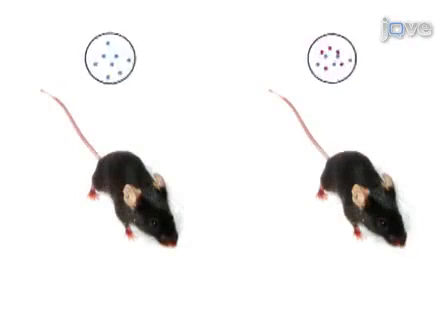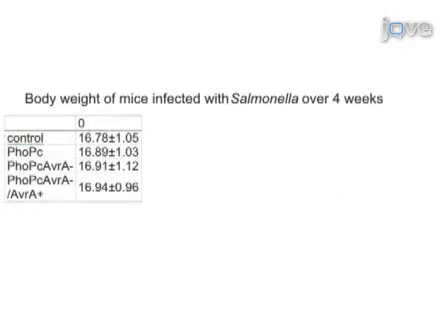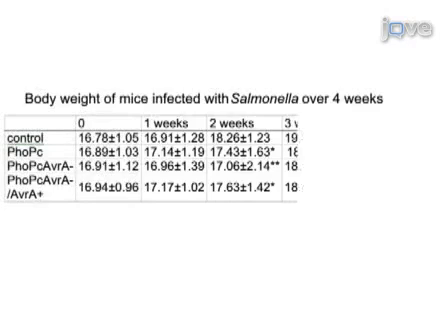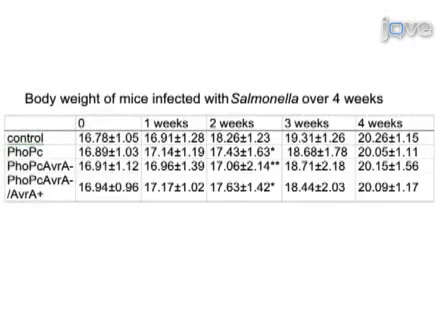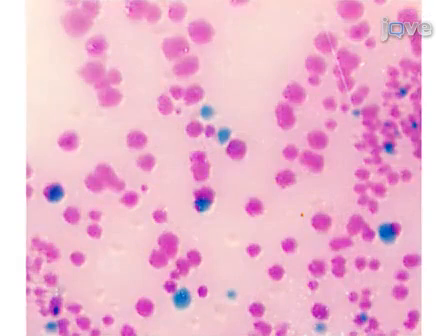The third step of the procedure is to isolate Salmonella from mouse fecal matter and detect Salmonella infection in mouse intestine using BBL CHROMagar plates. The final step of the procedure is to observe and record mouse body mass and note changes in vitality following Salmonella infection. Ultimately, results can be obtained that show an infection of Salmonella can be established in the intestine of mice gavaged with Salmonella.